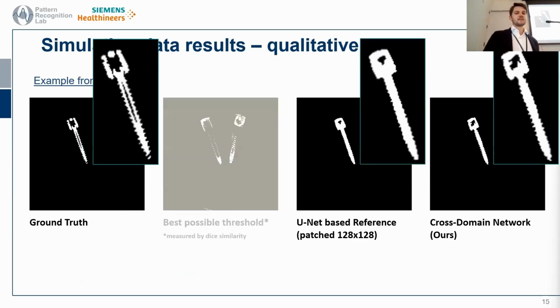A more detailed look at the segmentations of both learning-based models doesn't reveal much difference, I would say. And I would be cautious to read too much into a comparison between those two, because as I said, we work on downsampled data as well.